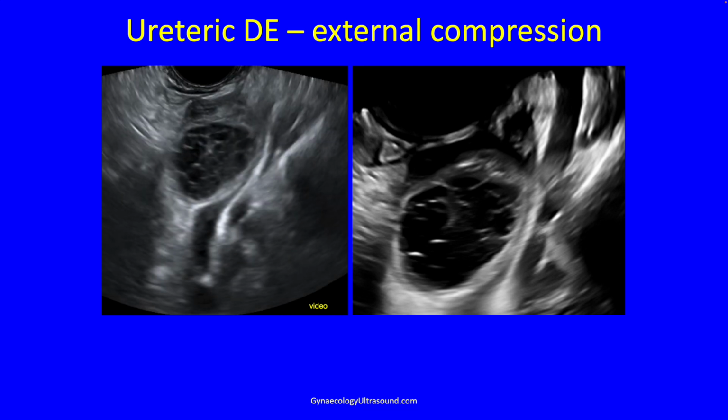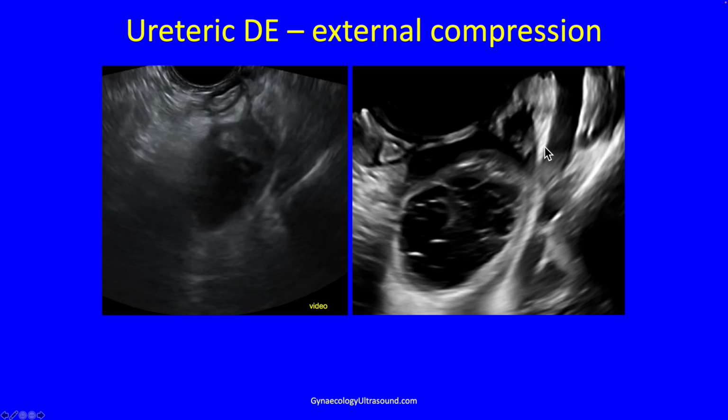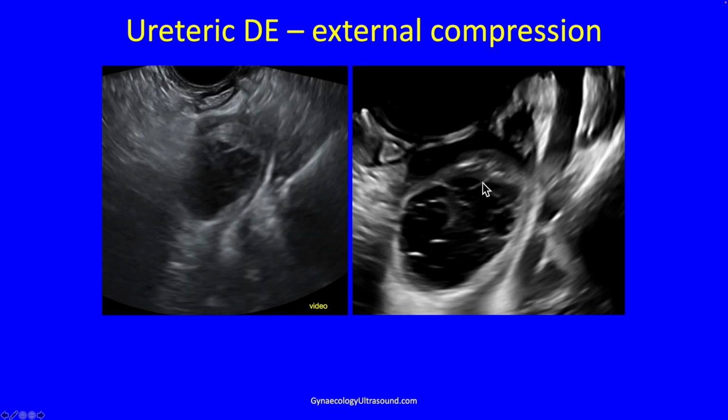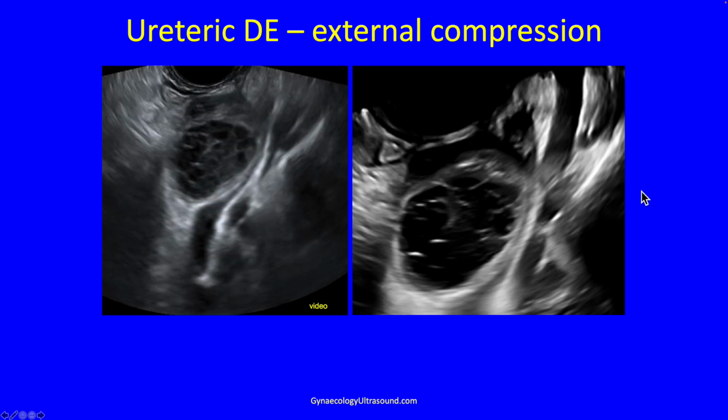So I showed you the 2D and there's the 3D. What 3D has added here is that you can see the nodule of deep endometriosis that's gluing the ovary down low in the pelvis, and you can see it almost looks like it's an invasive lesion, doesn't it?